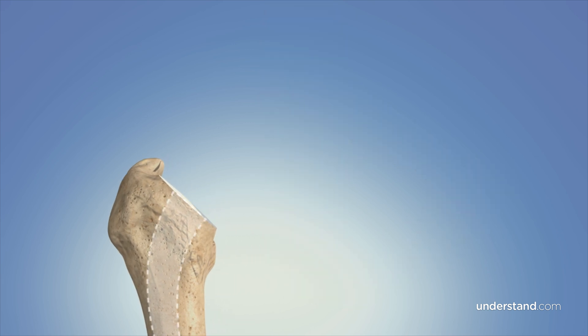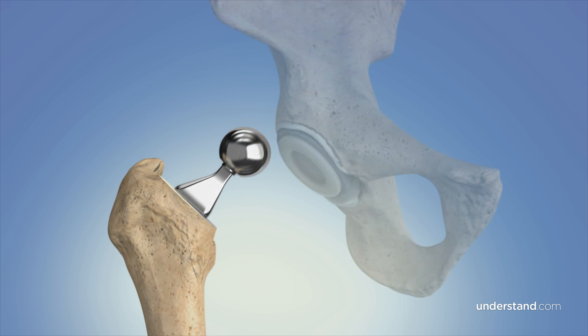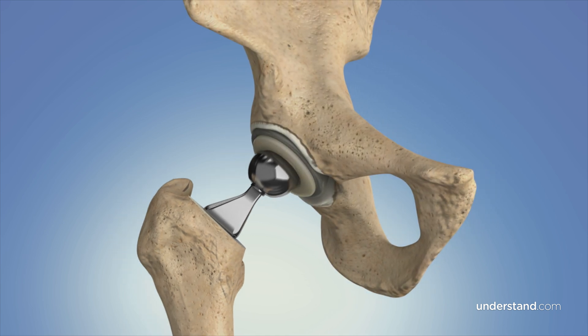The bone of the femur is then hollowed out and the implant stem is cemented or press-fit into the bone. Finally, a metal or ceramic ball is used to replace the femoral head.